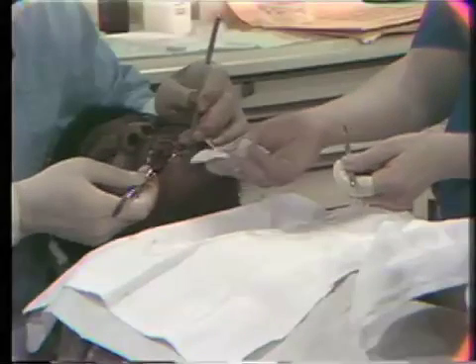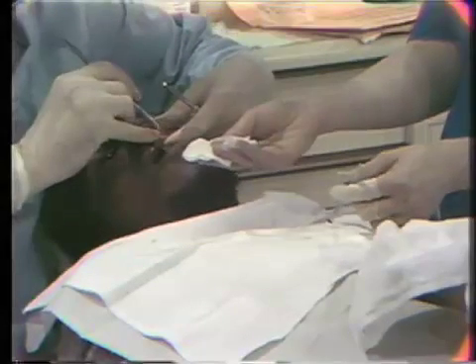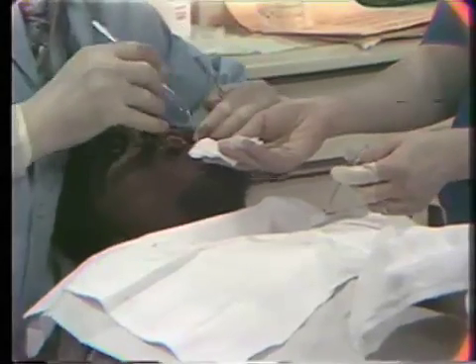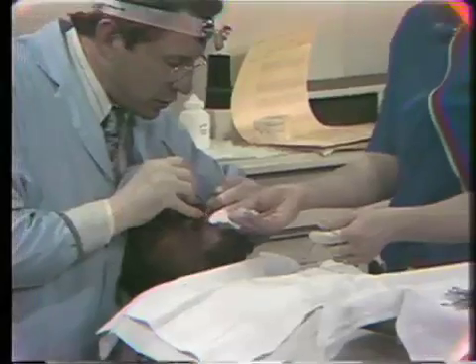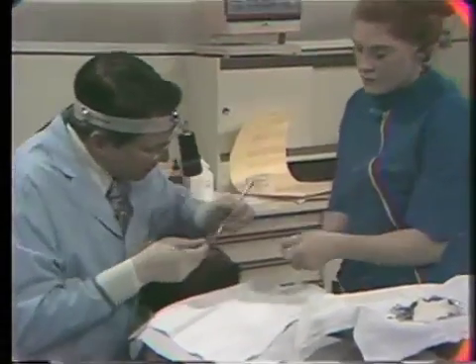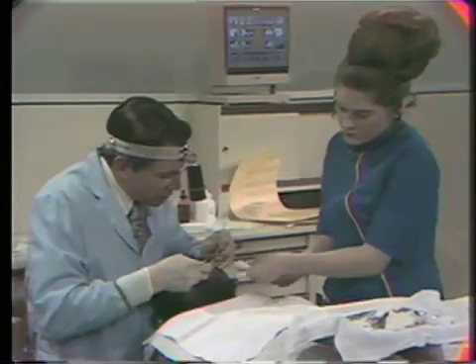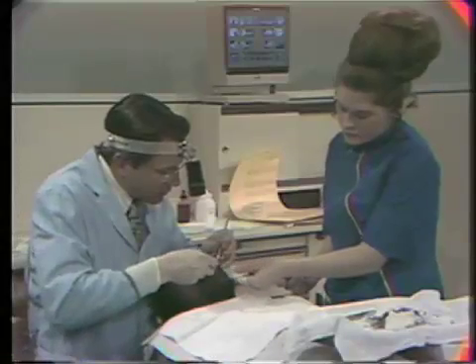Now with these cotton pliers, I'm pressing the dressing material interproximally, both from the buccal and the lingual. And this provides your mechanical lock. Now notice how she's standing there with a sponge and a plastic instrument. Now sometimes with the tweezers I'll remove excess dressing material, and sometimes I don't. And this time I won't have to. So she hands me the plastic instrument that'll be used to remove the excess dressing material, since we do want to trim it off so it doesn't interfere with the occlusion.